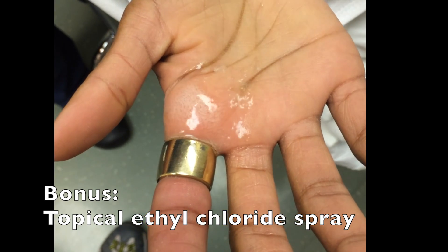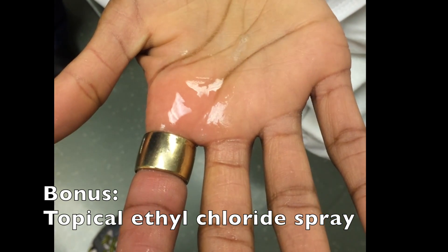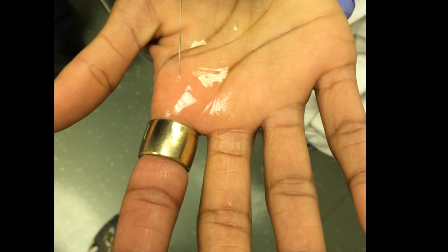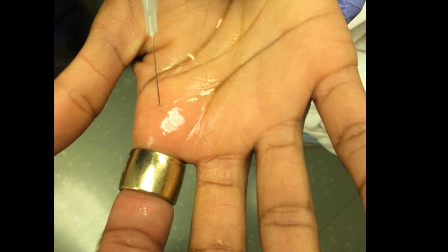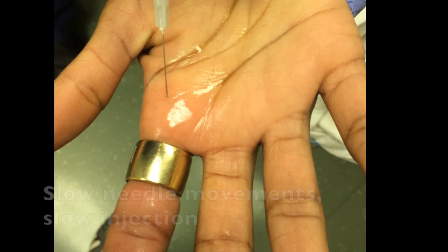As a bonus, because this is a painful area to inject, you can use a topical ethyl chloride or freezing spray in order to numb the skin before your injection. Again, you'll take that 27 or 25 gauge needle on a 3cc syringe. You'll inject at a 45 degree angle, advancing toward the finger distally.